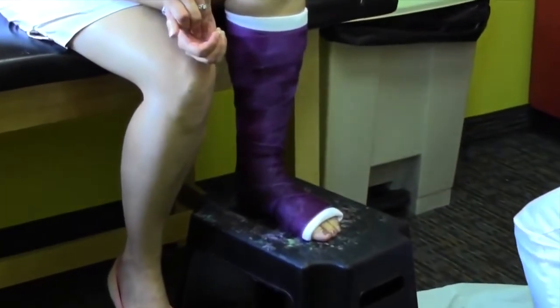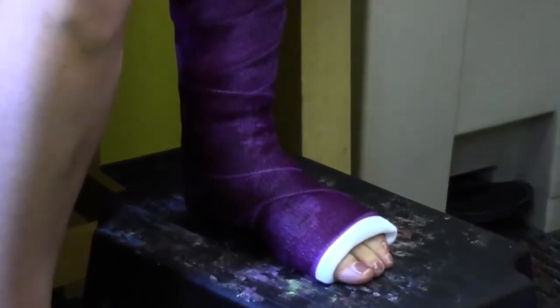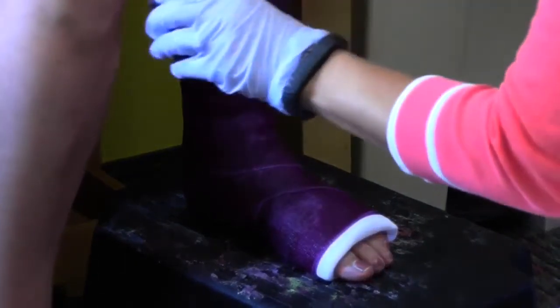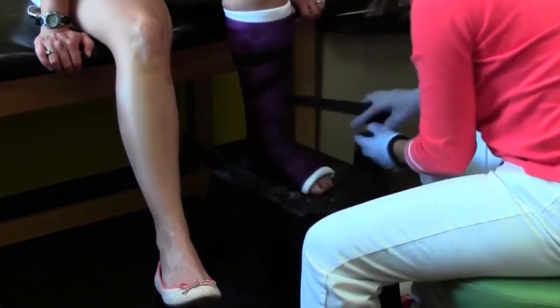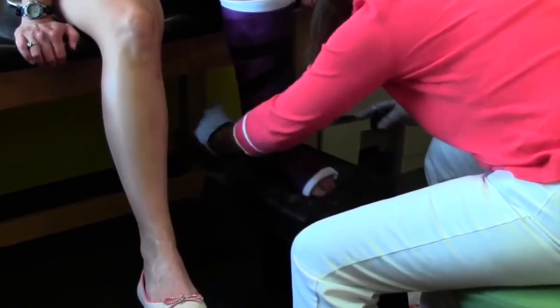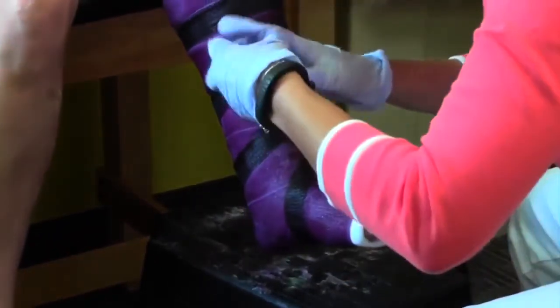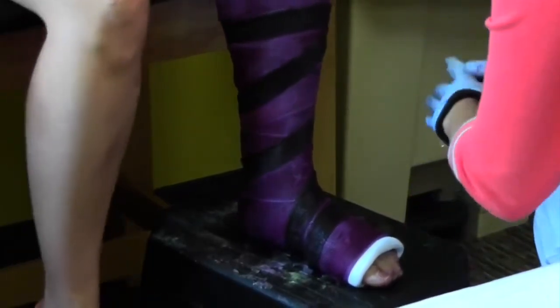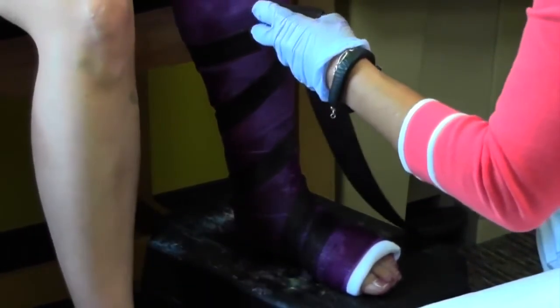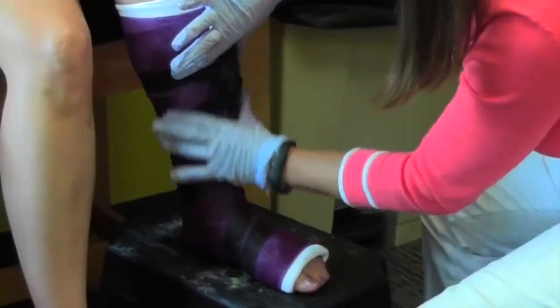If you want to do a little bit of fun decoration, you can add the decorative stripe. I like to fold the fiberglass in half. Makes a nice bold stripe that you can't see through. If the kids choose a dark color, they can get a silver Sharpie. It'll write on anything. Everybody's worried about being able to get their signatures on the cast. And you can finish it off with a little very un-Dr. Bray-like decoration.